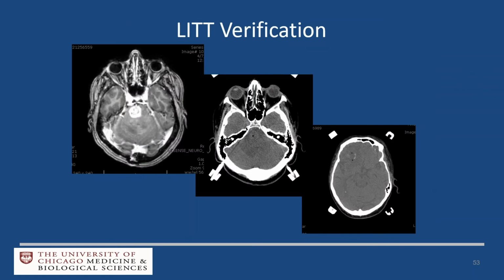Another tumor application, but also an epilepsy application, so this leads to the next topic almost, is verification of an interstitial stereotactic laser fiber implanted for then an MRI-guided laser ablation. So we do this all with intraop CT, and the beauty of the laser fiber, using the Visualase system, is it has a saline cooling catheter around the laser fiber, and that's filled with air, and you can see the air dot beautifully, and it tells you exactly where your laser fiber is.